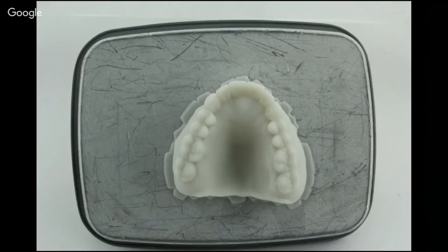These happen to be one of the sets of Mitch Hurst teeth. And so you can see this really beautiful, nice anatomy that's in them. I used that library of teeth because I'm running an alpha version that isn't publicly available yet. And so I've generated a full contour monolithic denture and then 3D printed this thing out.